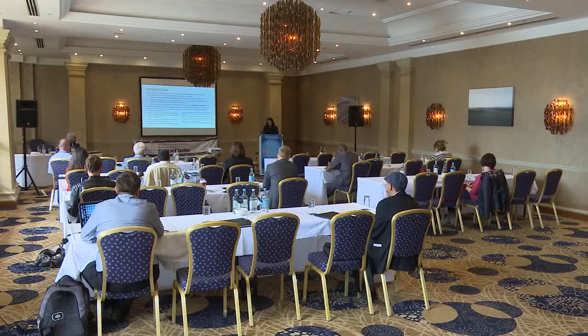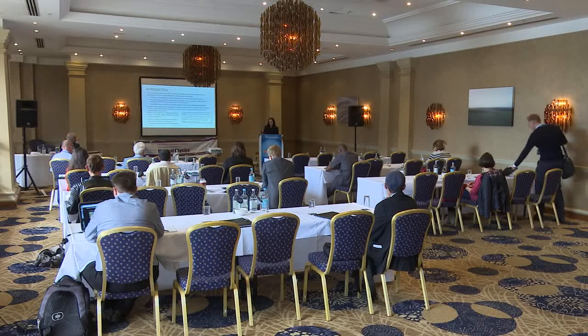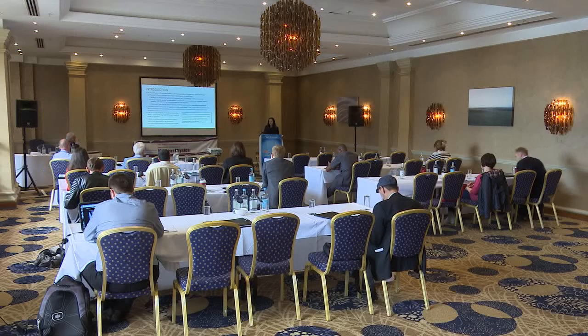Therefore, fluoroscopically guided interventional procedures are now an area of special concern in relation to radiation protection. It has been recognized that application and use of diagnostic reference levels represents an efficient and substantial standard for radiation protection of patients and optimization of fluoroscopic procedures.